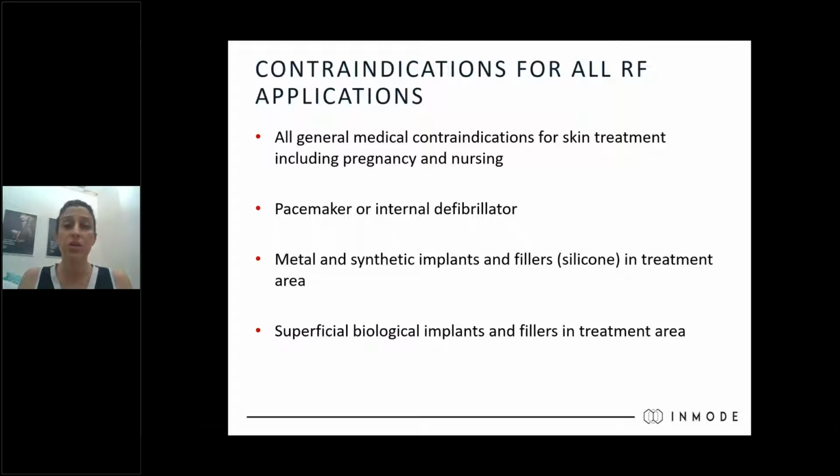But since we are working on the dermal layer and we're hitting it to quite an efficient extent, I recommend you do not apply Forma Plus applicators on areas that were injected with fillers. Botox is not a problem because after it binds, okay? So take a safe timing gap, and 2 weeks post Botox injection, you can go ahead and treat your patients.